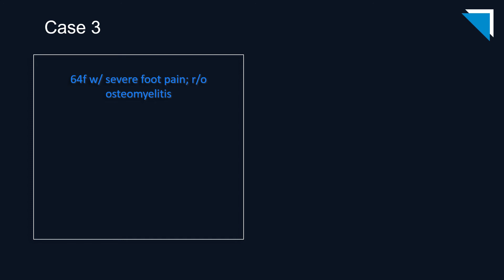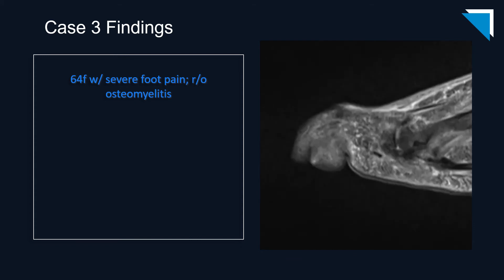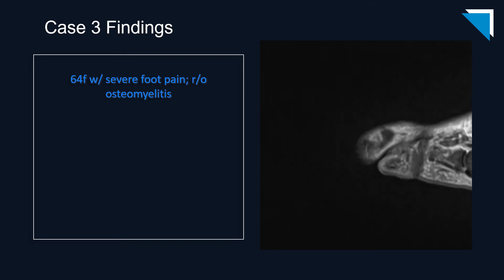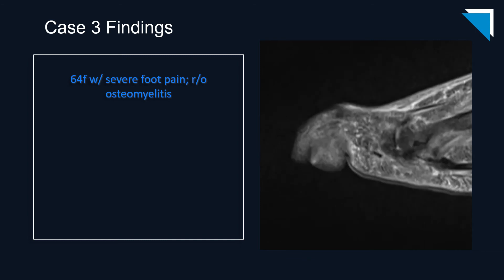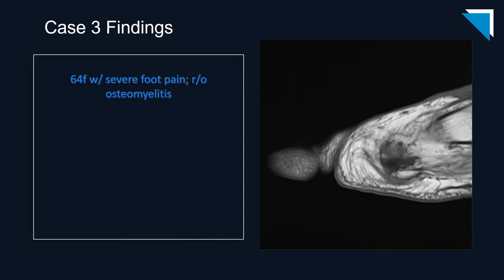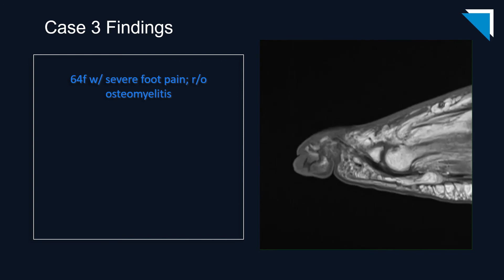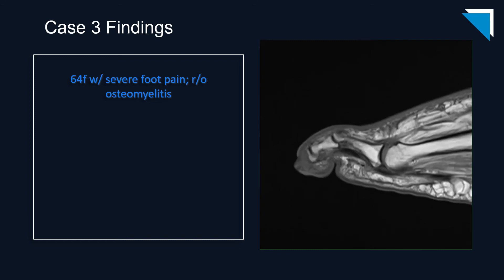Our third case is a 64-year-old woman with severe foot pain for rule-out osteomyelitis. We frequently do not receive localizing information from referring clinicians, so it's our job to suss out the area of interest based on our search pattern. I'll start with the sagittal fluid-sensitive sequence because the finding is most obvious here. As we scroll through, the area that stands out is the third distal phalanx, which demonstrates marked bone marrow edema and an adjacent soft tissue ulceration. Moving on to the sagittal T1-weighted sequence, we do in fact have associated T1 hypointensity and even some erosive or destructive change in the distal phalangeal head and shaft.